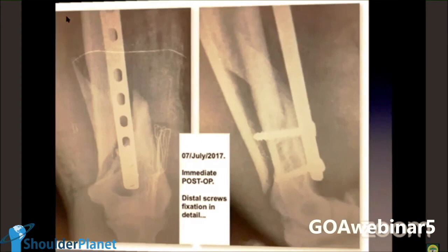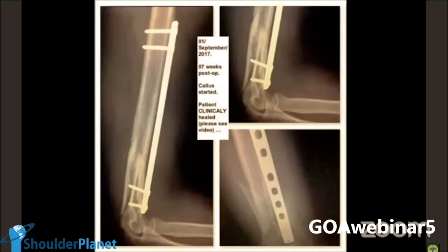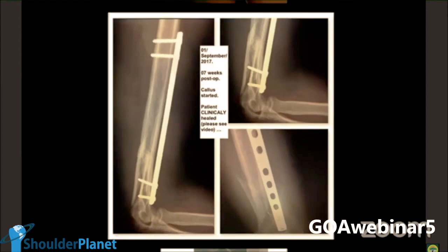And this is 3 weeks, absolutely nothing in terms of callus. This is super important now. Clinical healing precedes radiographical healing. Basically nothing radiographically, clinical healing precedes. So let's see the boy, 7 weeks. Attention, everybody.